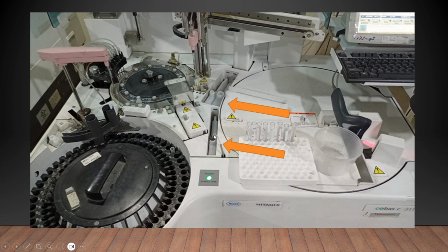Okay, only the reference is not closed actually. It is not picked up by the reagent probe. Instead they have a separate pipe for it, so for that reason it is outside. It has got a pipe attached to it. Otherwise they are all open. So this is the diluent, the internal standard is always bigger, and then the reference. So like this. Okay, they are always outside.